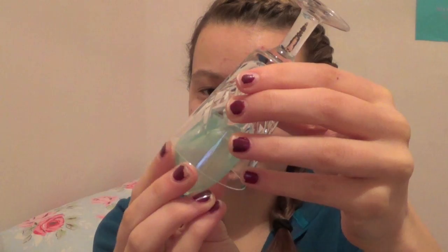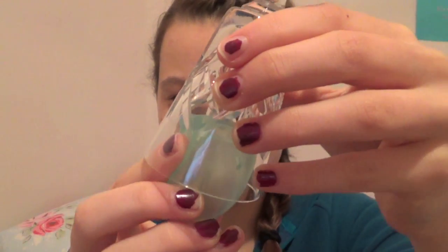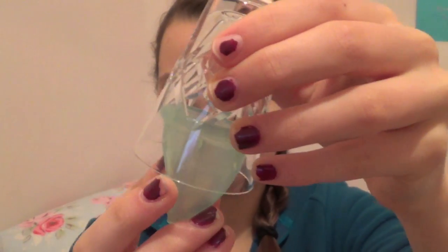Another thing you can do, and I'm just going to fold this up with the C fold to do this next bit, is you can actually just push on the cup very gently here to get some air into the cup. I need to pull this down a bit because it won't. There you go. Just get some air into the cup like that by pressing a little bit, and that can help to get the cup in as well.